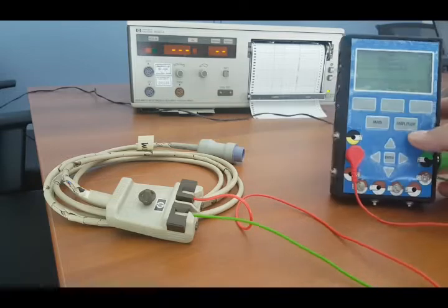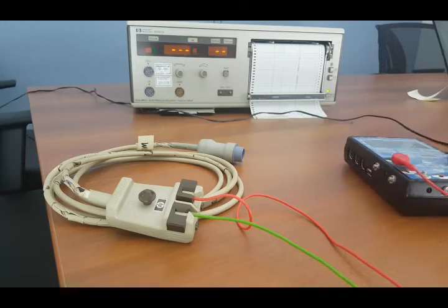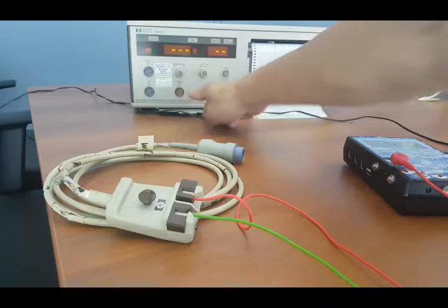Right here, I do have a unit right in front of me. It's already been connected and powered on. Behind me here, I have a Hewlett Packard 8040A monitor. I have three inputs here: an ECG input, an ultrasound port, as well as a TOCO input.